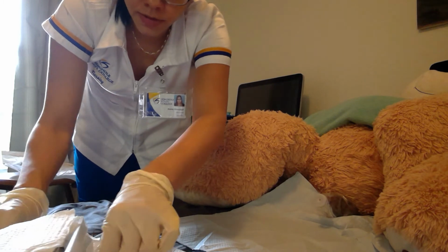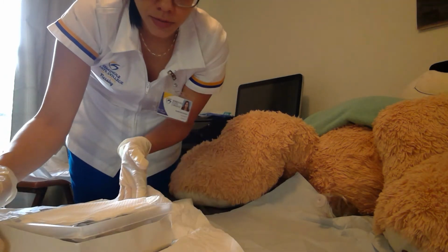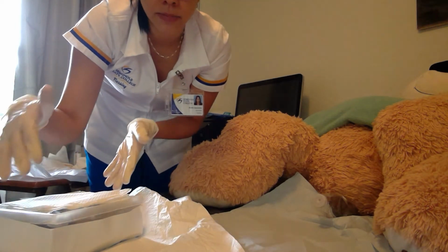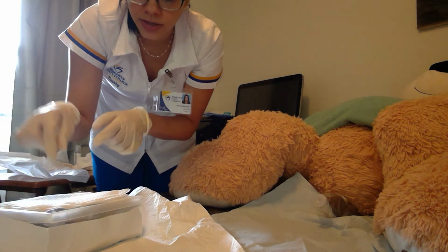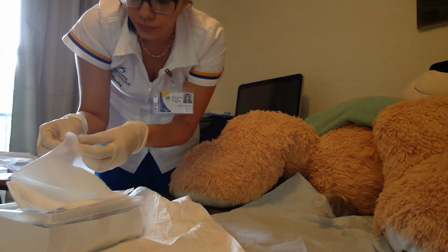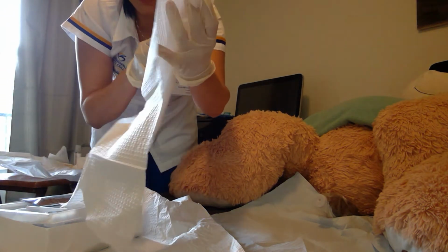Okay, same with my tray. And I have my tray here. I can touch whatever I want on my tray because my tray is sterile, so are my hands. Okay, so the next thing I find in here is my fenestrated drape. And this one has a hole in it.